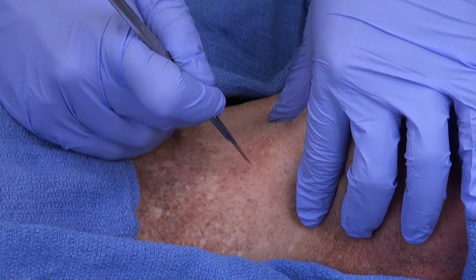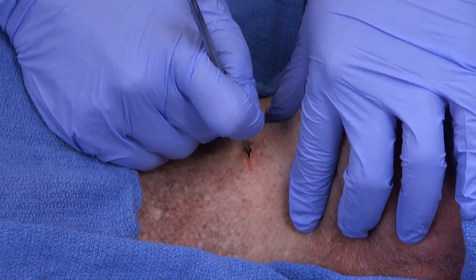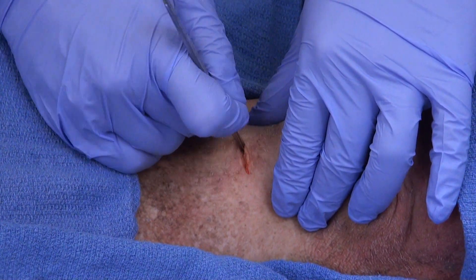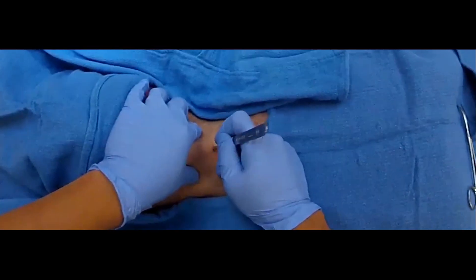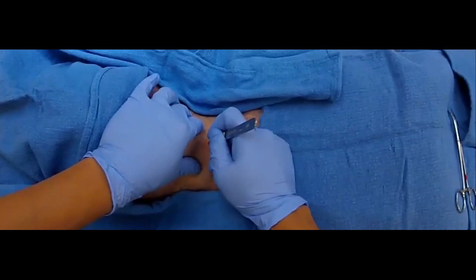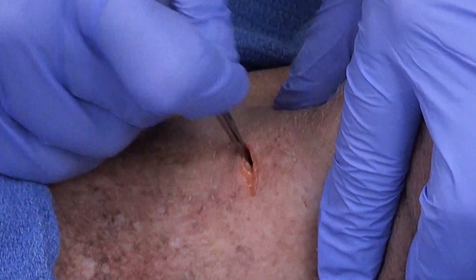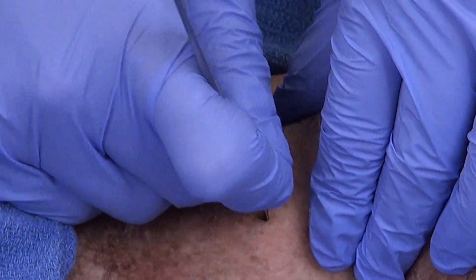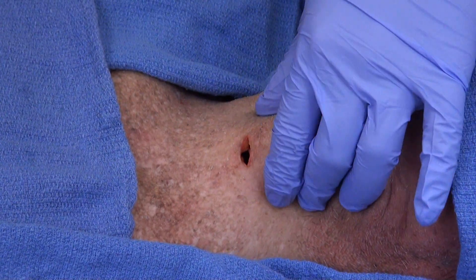The incision should be placed directly over the cricothyroid membrane using a number 11 blade. There is debate among surgeons with regards to the optimal type of incision, whether it be vertical or horizontal. Advocates of a vertical incision state that it is an extensile incision and may help to avoid iatrogenic injury to the anterior jugular veins. Those that advocate for a horizontal incision state that a single incision may be created which is taken through the skin as well as subcutaneous tissues and directly into the airway, thereby avoiding two separate incisions.